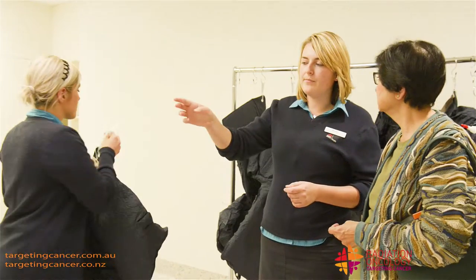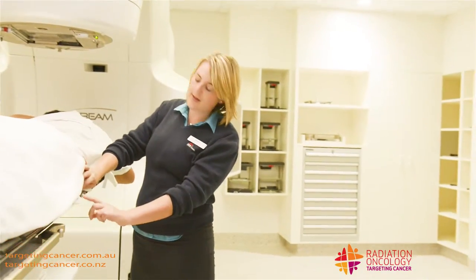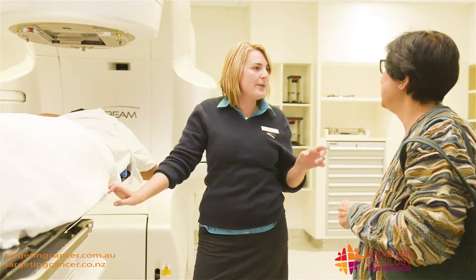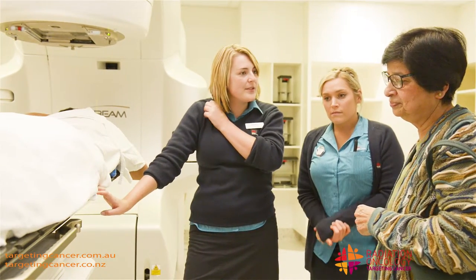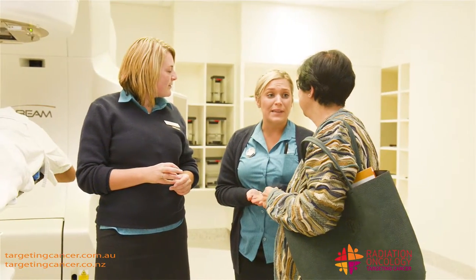All of our different set-ups are locked onto the bed. We've got little notches, as you can see on here, and all the different equipment locks on. So we've got exact positions that are worked out from the CT session, and for each patient we try and make it as comfortable as we can for them.